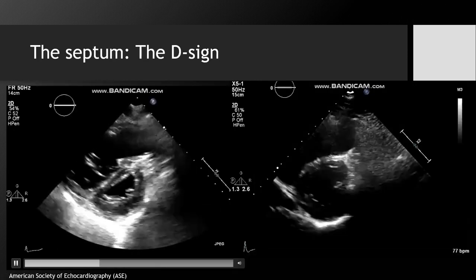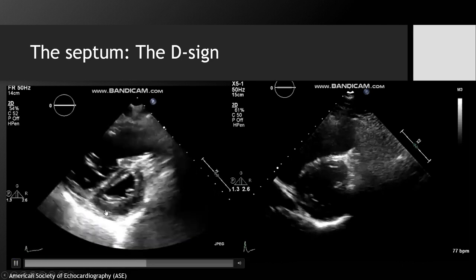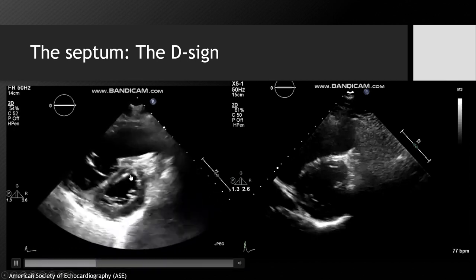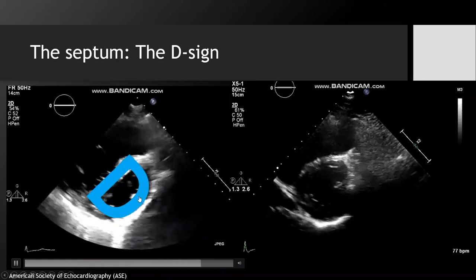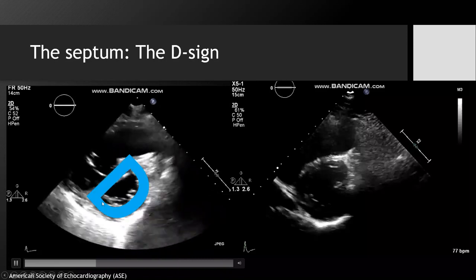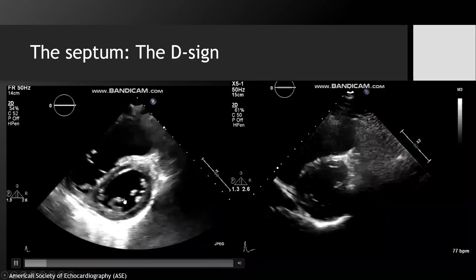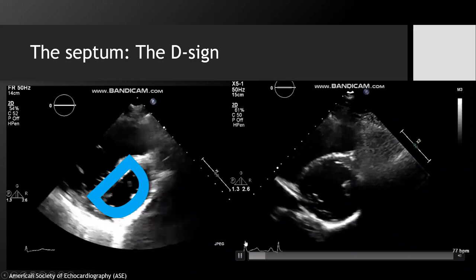So let's get back into the septum, and here we're at one of the papillary muscle levels. Now, you are probably noticing that this is extremely abnormal, and here you're having what's called the D sign. It's called the D sign because the septum usually flattens, whereas the rest of the LV remains circular. So you have a flattened septum, circular D shape here. You might also appreciate that we have a pretty large RV here, and it's impacting the LV, and it's making this D shape.